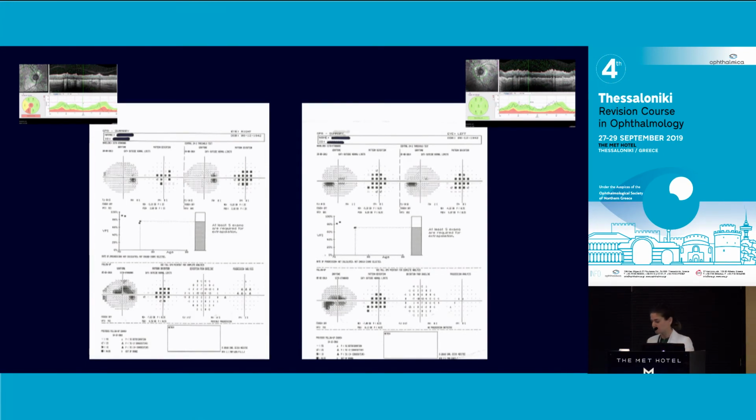It's not good. The left disc, very similar. So you don't have a lot of tests to get the projection. Nothing very typical here, no progression there, but the pressure is high. Of note, this patient didn't have any problem at the macula. His vision was fine, and we did a macula OCT, and presumably we were able to interpret it, so he was fine.